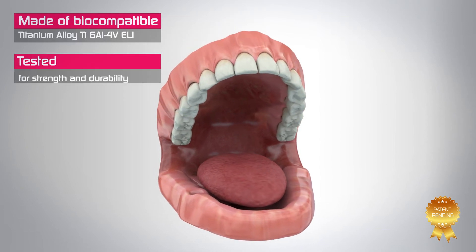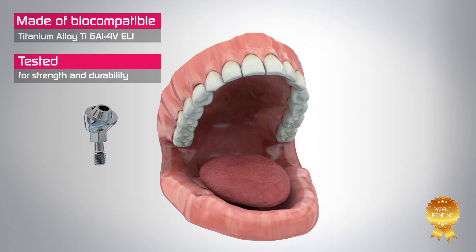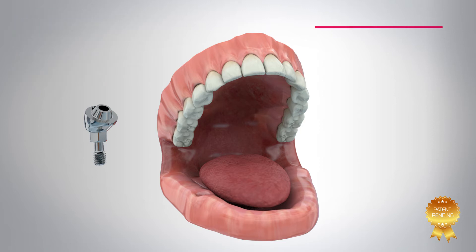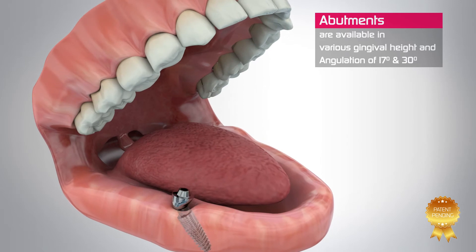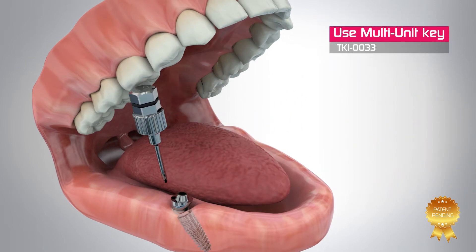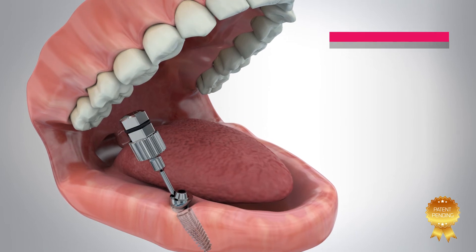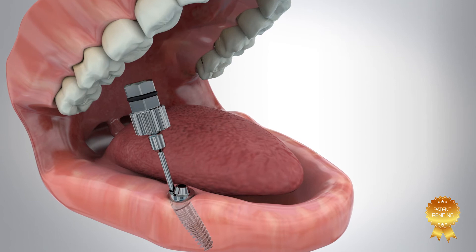This simple abutment is an excellent option to restore even compromised edentulous cases. The TAG multi-unit abutment system is the perfect solution in cases where angulation correction is required. Place and tighten using the angulated multi-unit key to 25 newton centimeters.